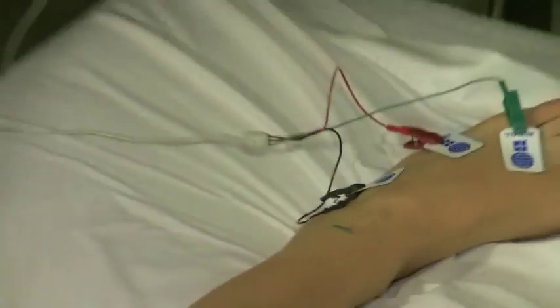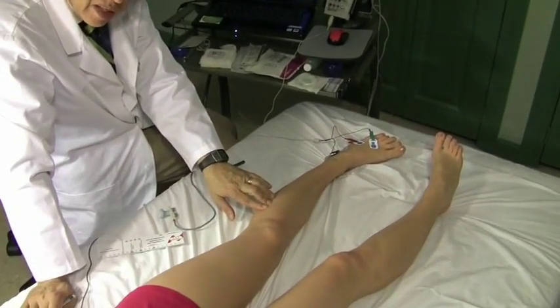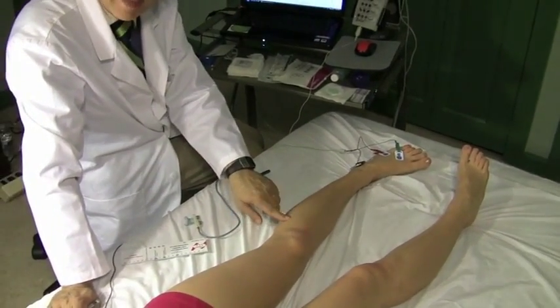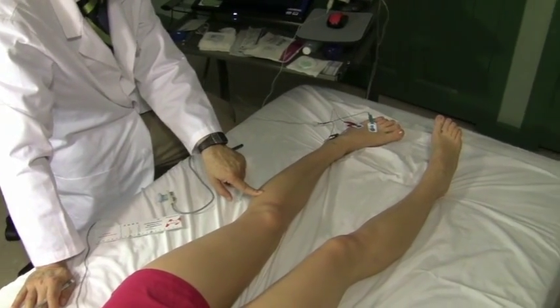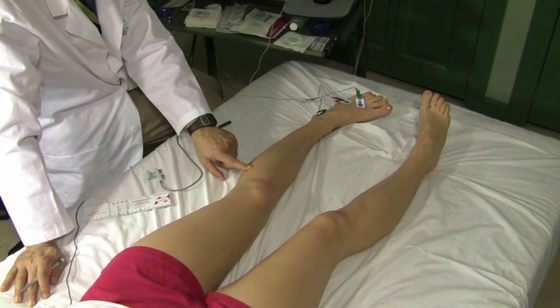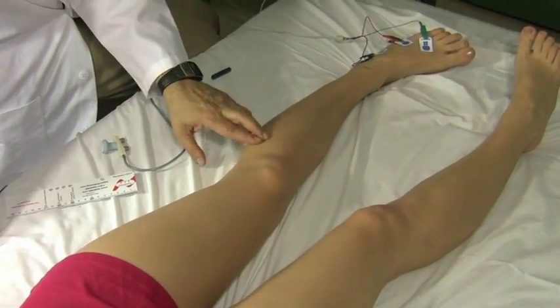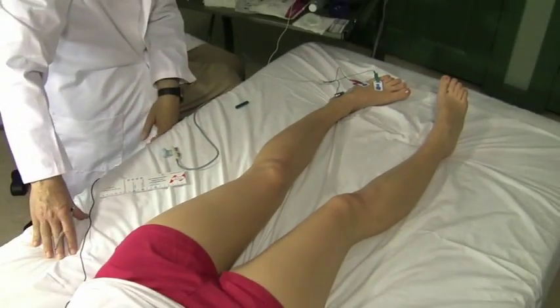And for the peroneal, like for the ulnar, we do 3 stimulation points. Because sometimes if you cross your legs and if you cross them very hard, or if you lean against a sharp object, you might actually damage the nerve right here, right below the fibular head. The fibular head is this bone that protrudes out of the knee like so. So below the fibular head, the nerve may get compressed, and so I want to study the nerve below the fibular head and at the knee above the fibular head. So if the nerve is okay from here to here, but not okay from here to here, that means there's a problem at the fibular head. That's called peroneal neuropathy at the fibular head.